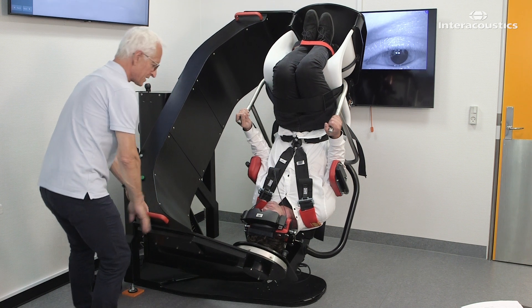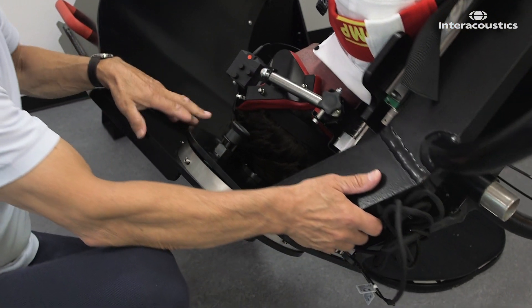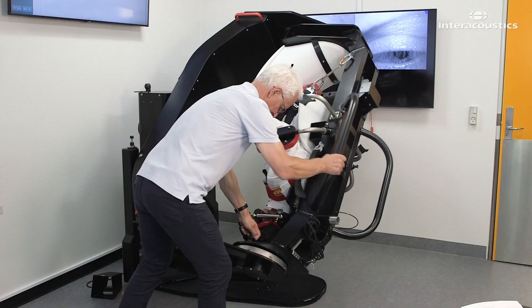Repeat this process three more times for a total of five positions, each time turning the patient 45 degrees over the healthy ear. Apply 12 rapid decelerations in each position.